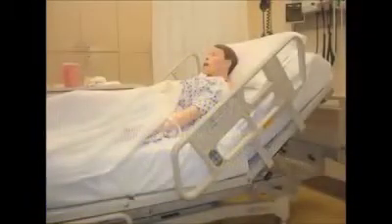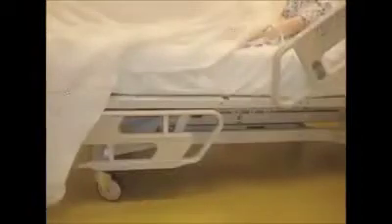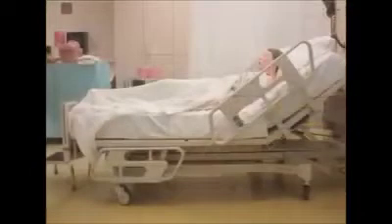When the patient is able to get out of bed by him or herself, you must leave at least one of the rails down and the bed in its lowest position so that the patient can get out of the bed without risk of falls.